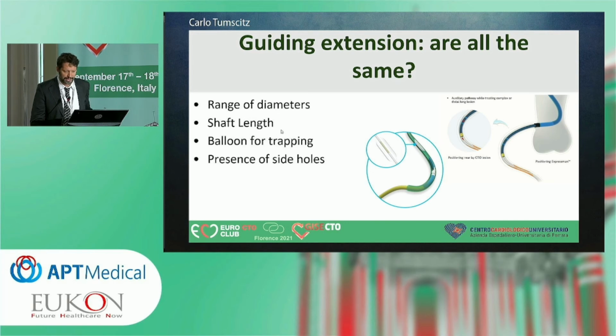The shaft length is different, so this length in some brands it's just 20. There are other brands who have 20 and 40. In APT, they decided to go to 35. I think it's clever because it's long enough to go very distally.